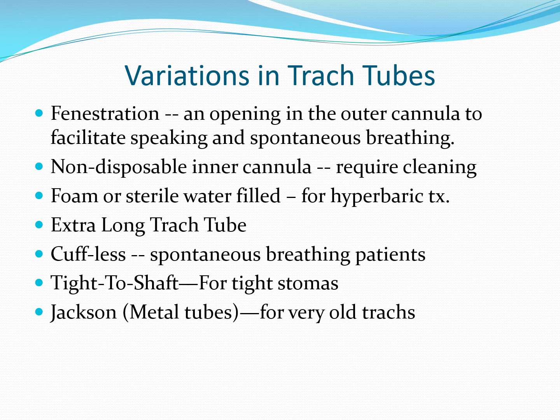Non-disposable inner cannulas, you can occasionally see them as well. In one of the ensuing slides later in this presentation, I will show you what an inner cannula cleaning kit looks like, the elements of it. They're pretty universal, to be honest with you. But those non-disposable inner cannulas do require regular cleaning in order to minimize any sort of plugging or any sort of infection risk. Foam or sterile water filled, you can also see them.